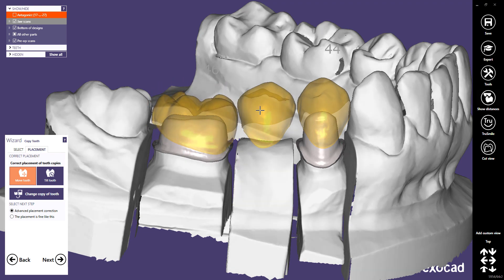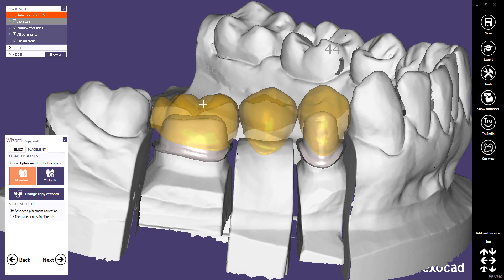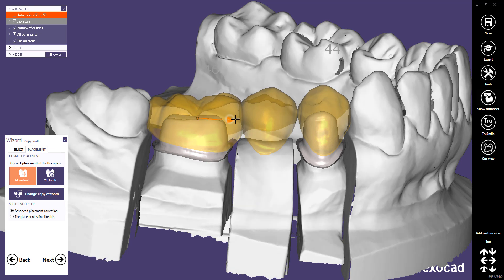Move a tooth with the left mouse button. Scale a tooth with Shift and the left mouse button. Rotate a tooth with Ctrl and the left mouse button. Scale a tooth in a desired direction with Ctrl, Shift, and the left mouse button. Using the Tilt Tooth button, you can only rotate teeth in the buccal-lingual direction.